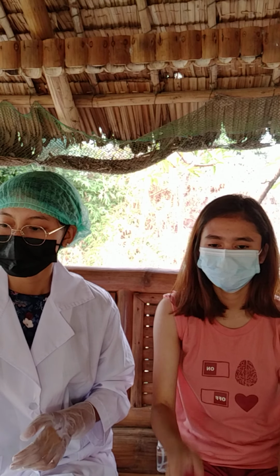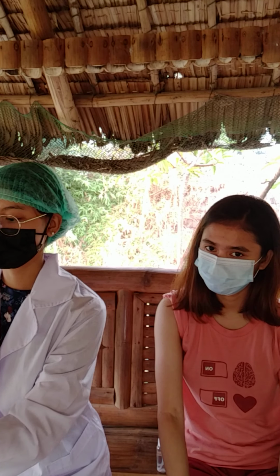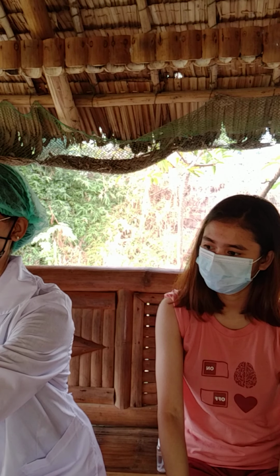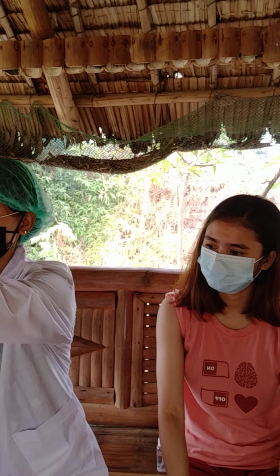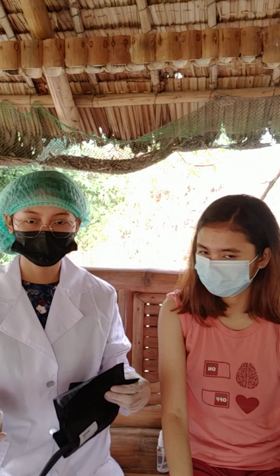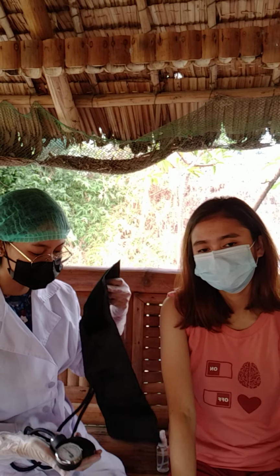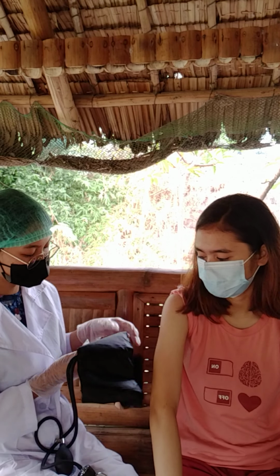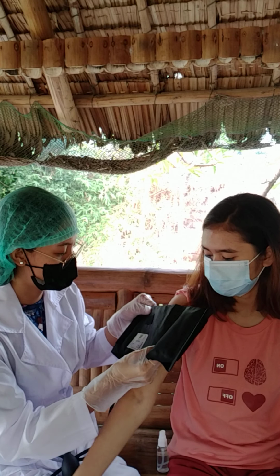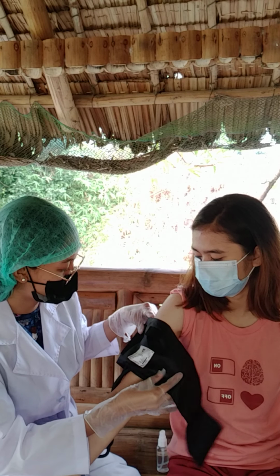So we have the sphygmomanometer here. And then i-wrap natin tong sphygmomanometer natin dito sa brachial part ng patient natin.